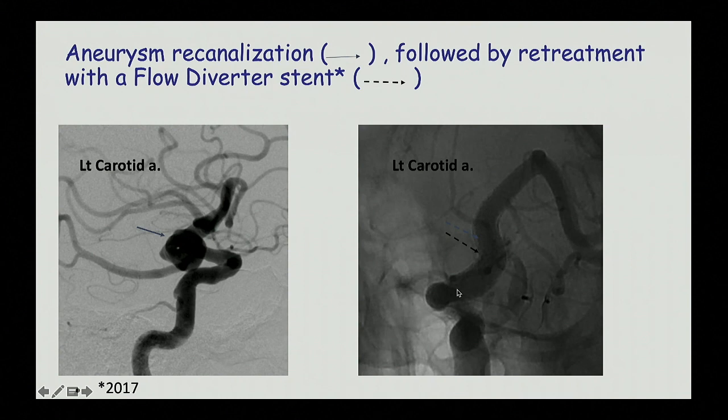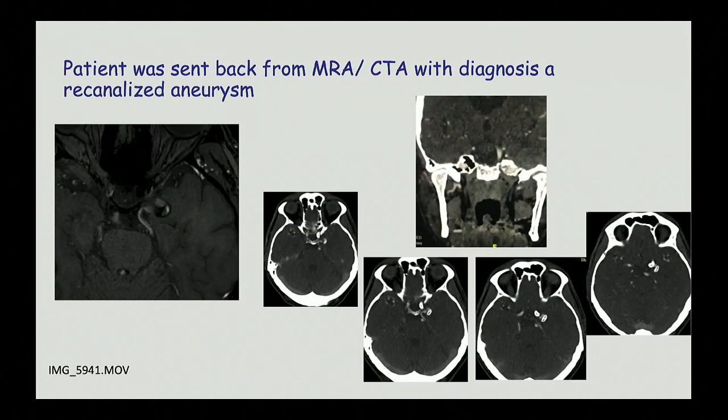But the patient was sent back after some time. I think it was another year later. The patient was sent back with this, and they said there is a recanalization of the aneurysm on MR. This is on CT. There's a movie. I hope it will be okay.